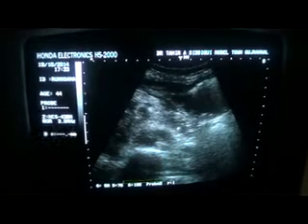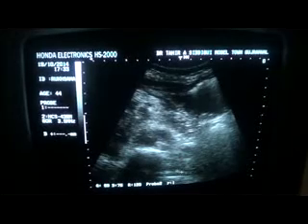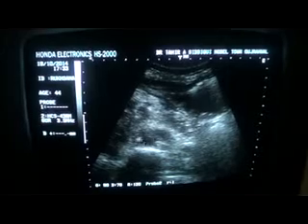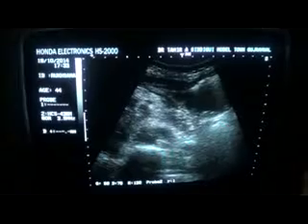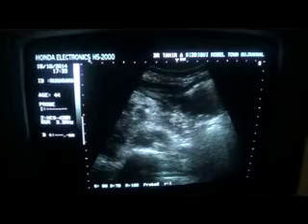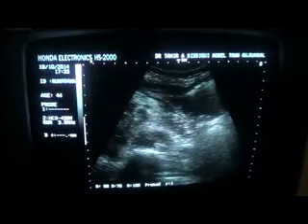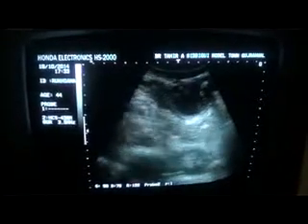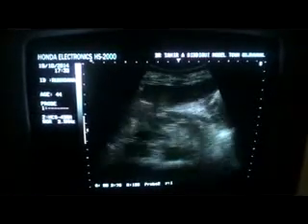Now in this view, I can show you only this much, that this is the pancreatic tail, this is the kidney in transverse section, these are the central sinus echocomplex, the aorta. Now this is bowel. We should not mislabel this area as the pancreatic tail. These are bowel. This is a bowel, and the stomach with the internal gas shadows. So nothing significant as we go further and study the pancreas.